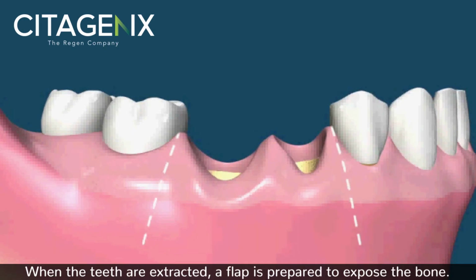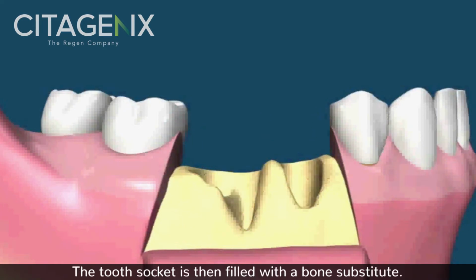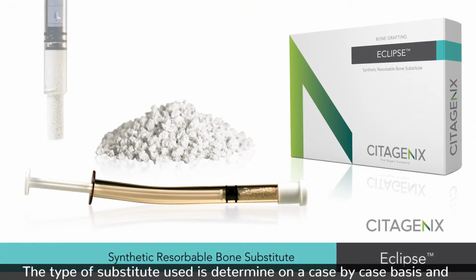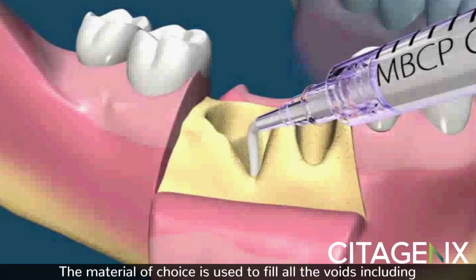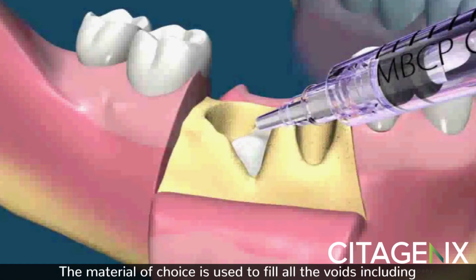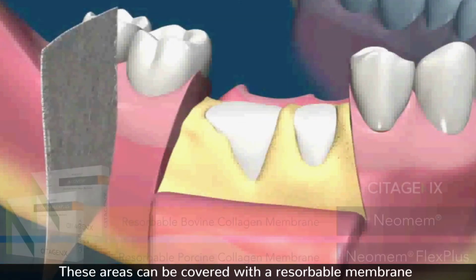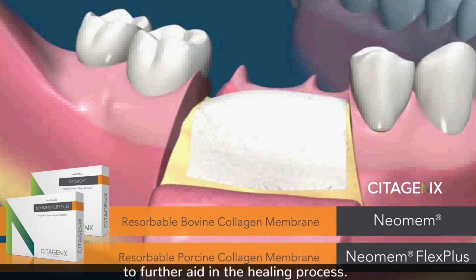When the teeth are extracted, a flap is prepared to expose the bone. The tooth socket is then filled with a bone substitute. The type of substitute used is determined on a case-by-case basis and may be a synthetic material or another that will stimulate bone growth. The material of choice is used to fill all the voids, including the tooth socket as well as any bone defects. These areas can be covered with a resorbable membrane to further aid in the healing process.